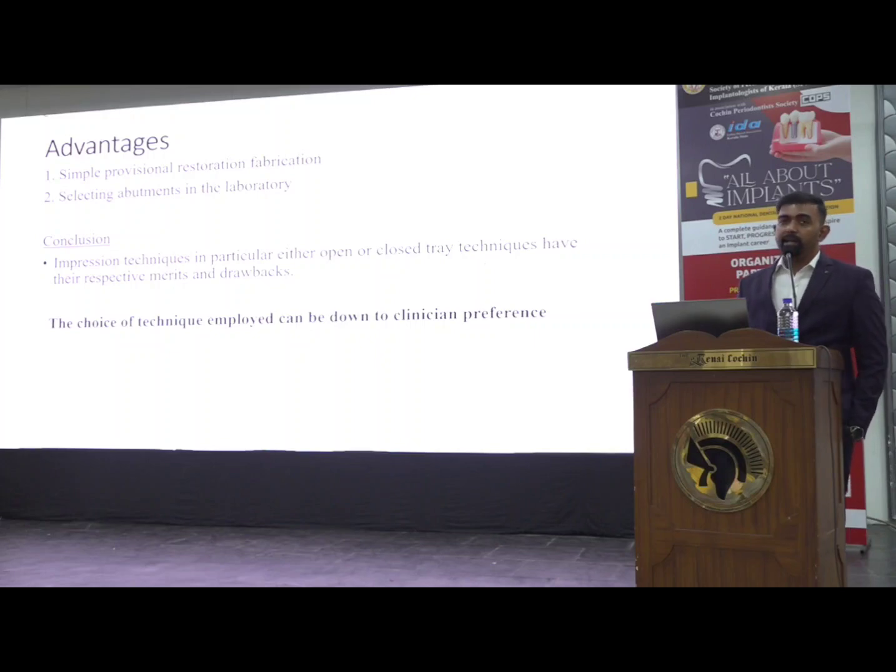Every impression technique has its own merits and demerits. According to the clinical situation, you should select which impression technique to choose: closed tray or open tray or abutment level. That's according to the clinician's preference.